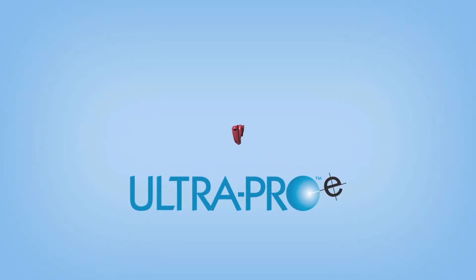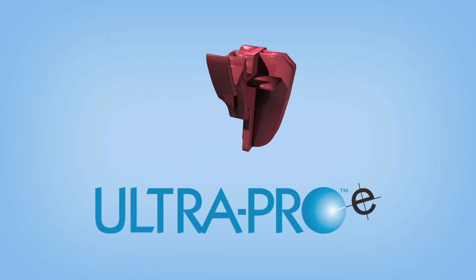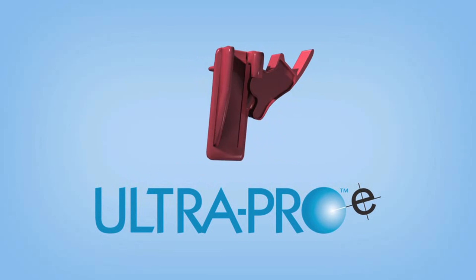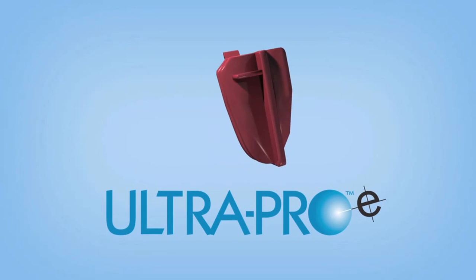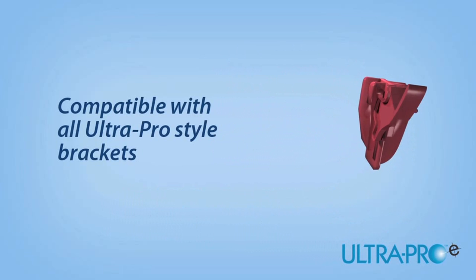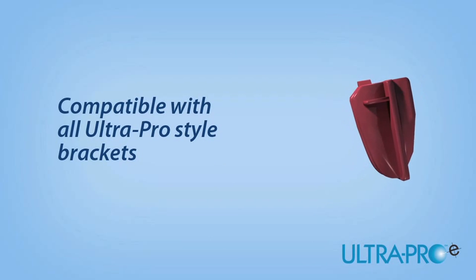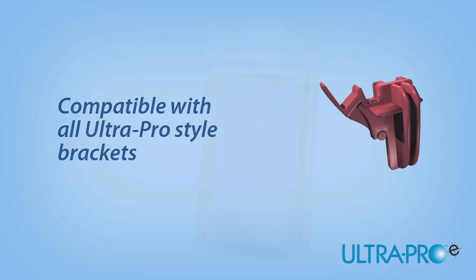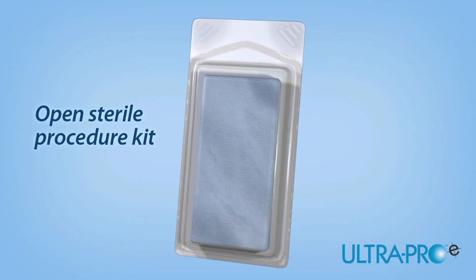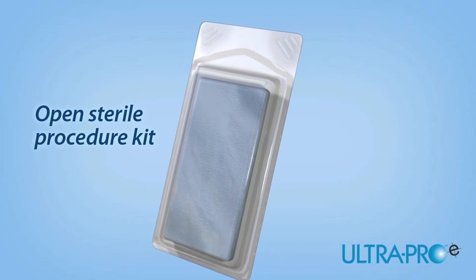Offering a unique, open channel design with infinite angle capabilities, the UltraPro E needle guide assures accurate, in-plane positioning during procedures where access is difficult. The UltraPro E needle guide is compatible with all UltraPro style brackets created custom for leading ultrasound equipment manufacturers. Each needle guide is conveniently packaged in a sterile procedure kit where the gauge size is pre-selected at the time of order.